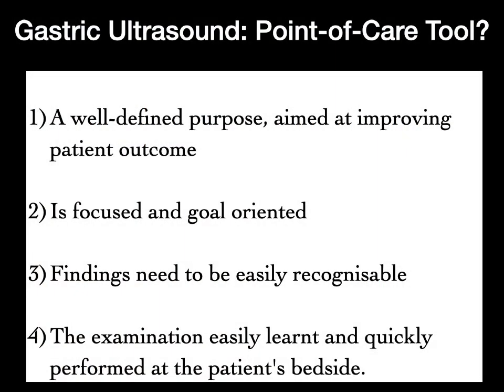Now before I finish, I want to tell you a few things about this. Of all the uses of bedside ultrasound, gastric ultrasound is a wonderful way of using it. It serves all the purposes of a powerful point of care tool. Does it have a well-defined purpose?